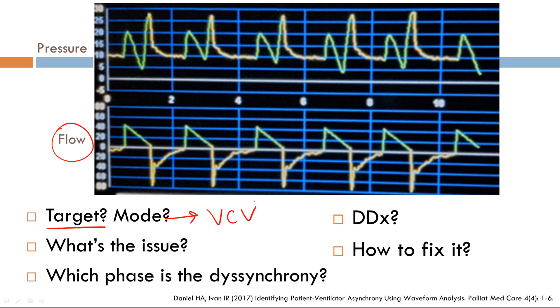So what's the issue here? Reading each scalar left to right, let's start with the pressure. The breath is triggered, so there's no issue with trigger. However, after the breath is triggered, you can see there's a negative deflection. The same is true with the second, third, and consecutive breaths. So the issue is not trigger, but it's target. A negative deflection in the pressure scalar means the patient is inspiring. As a result, this is a target dyssynchrony.